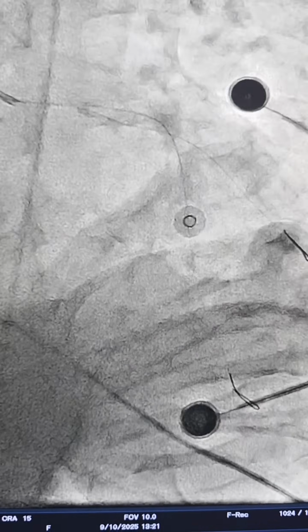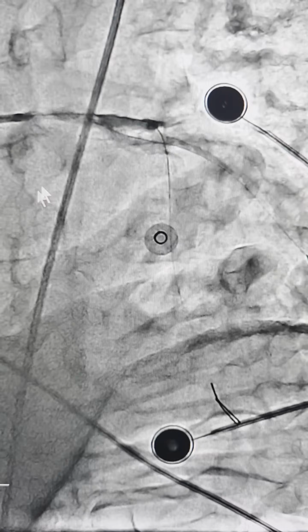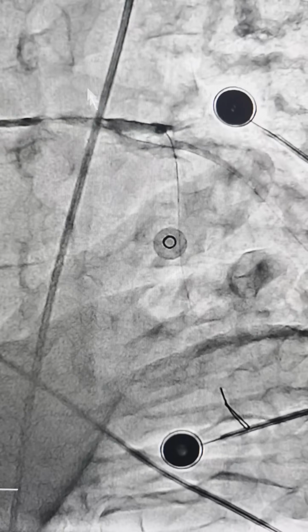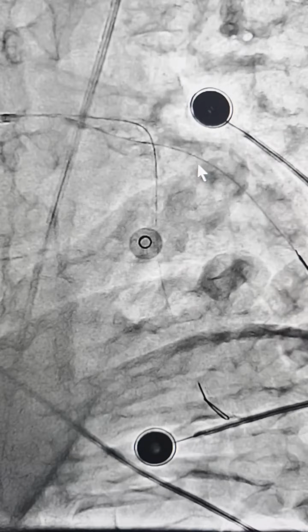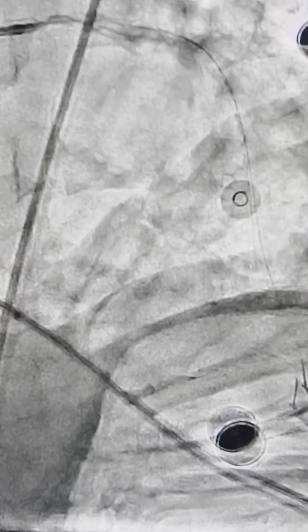Managed to get two wires in, and the artery was definitely, there was nothing there. I stopped the CPR, and this was all this was. The first picture we took on the fluoro showed that there was nothing going in at all, and again in this one there was nothing going in. We had just blindly put in the wires and did some balloons.